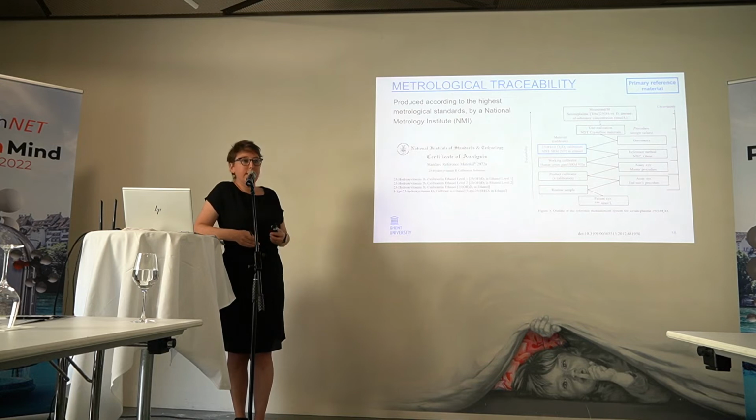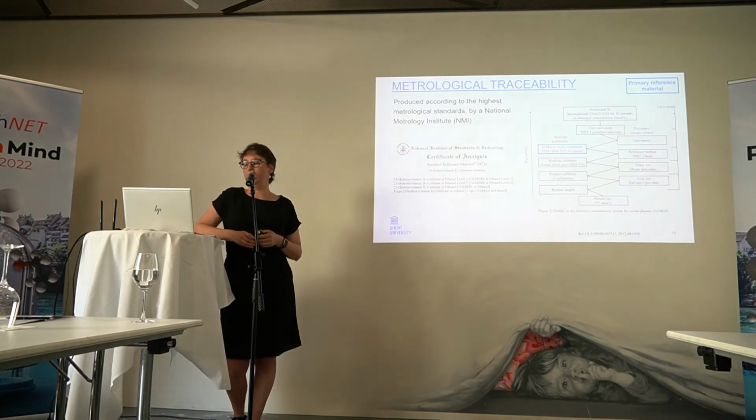Okay, the second key element in the metrological traceability is a primary reference material. We've discussed it yesterday.